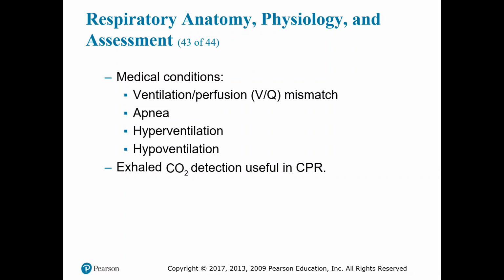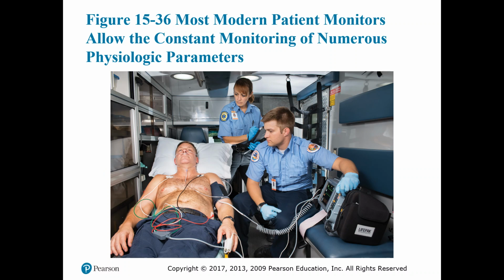Now we're going to discuss peak expiratory flow here real quick. Well, here's our patient on the monitor. You notice the LifePak 15. He's got end tidal CO2.